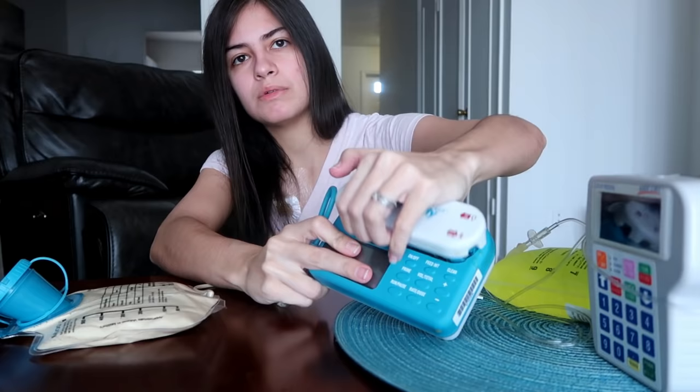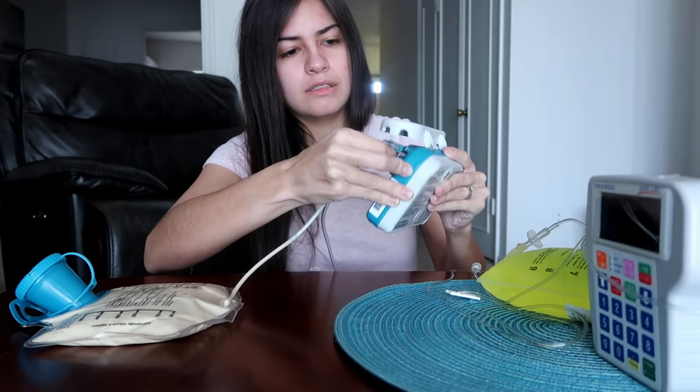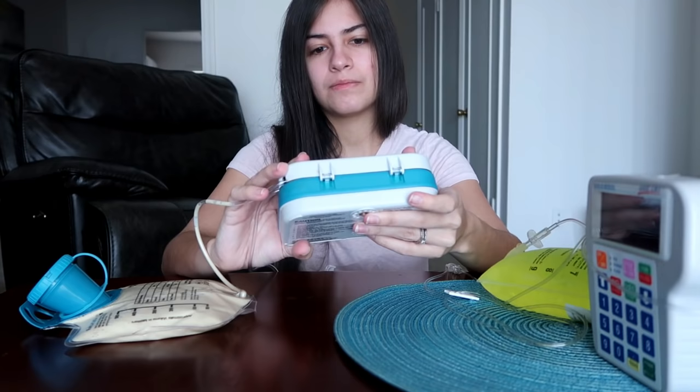So I open it. This little loop goes over this black circle here, and then it just stretches across. I swear it's easier than I make it look. It's just my hands are giving me issues today. It just stretches across and snaps in. Close the door, turn on the pump. Beep. This is a noisy thing.